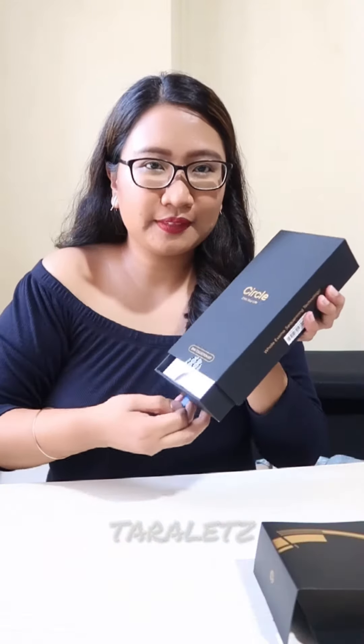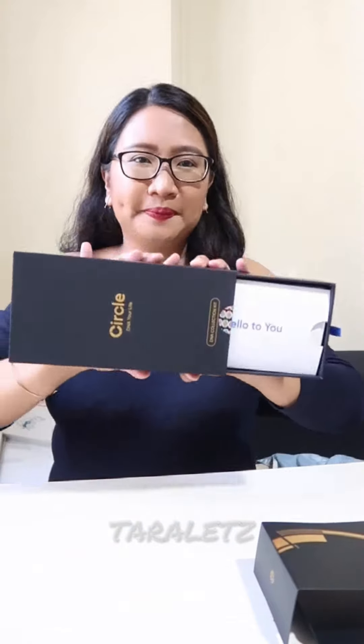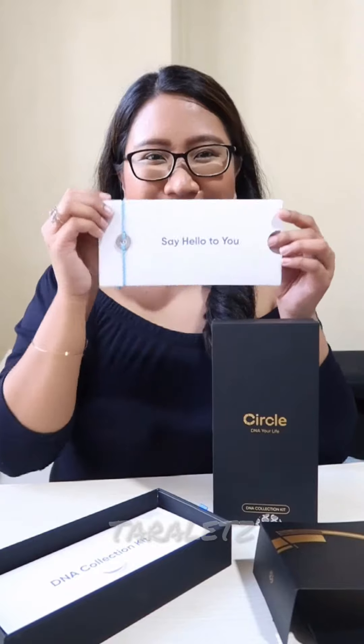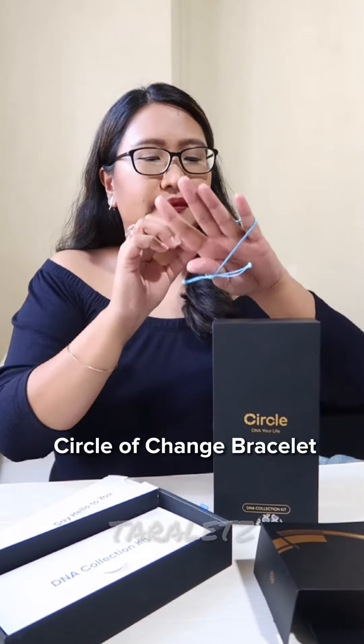So tara! Let's unbox and use this DNA testing kit. First we see here 'Say hello to you,' and it comes with a Circle of Change bracelet.